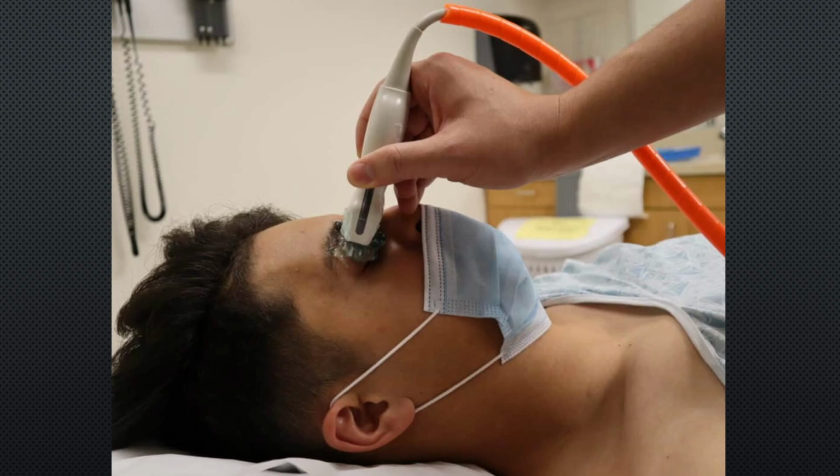You can use a Tegaderm and put it over their eye to protect their eye, but you're really not protecting their eye from much. It's just jelly. You can wash it off afterwards with a rag or something. And when you take that Tegaderm off, it can pull at their eyelids, their hairs, things like that, and can be a little painful for them.